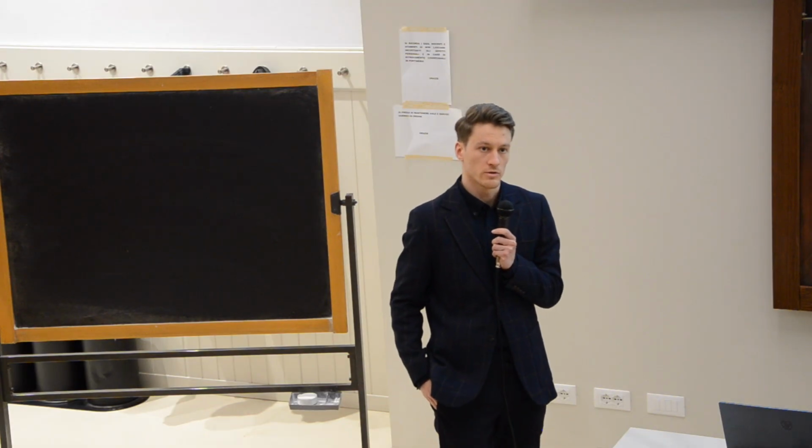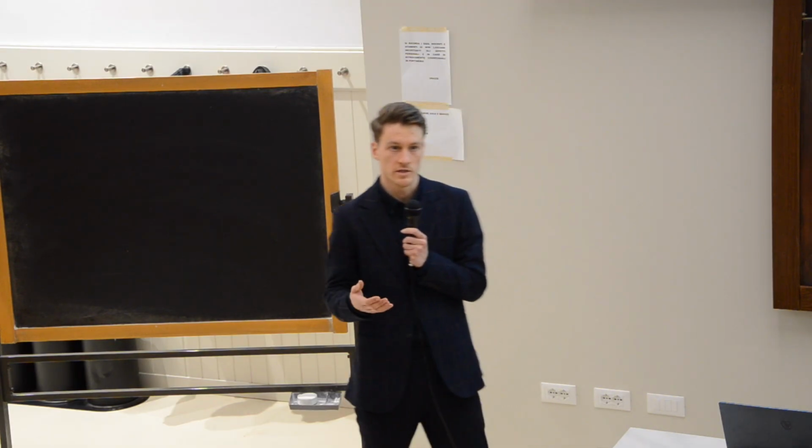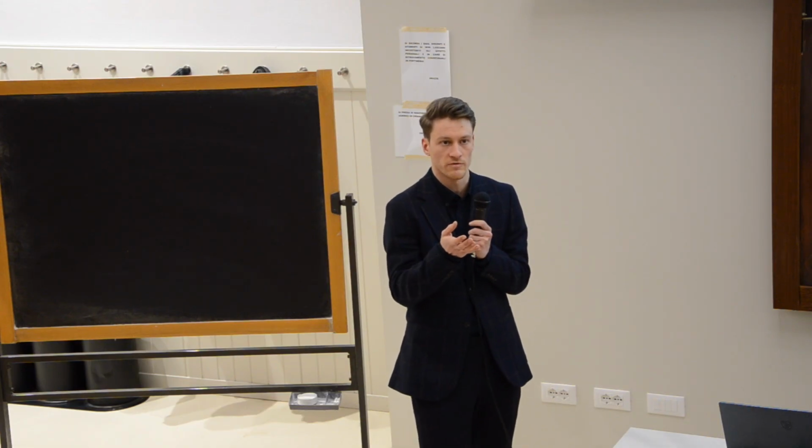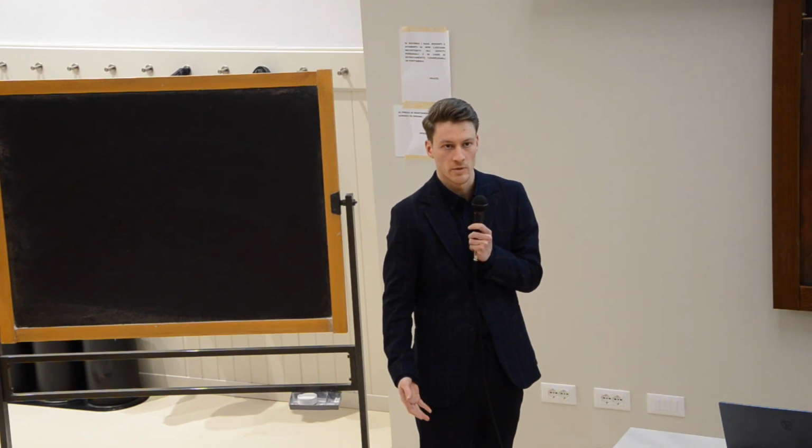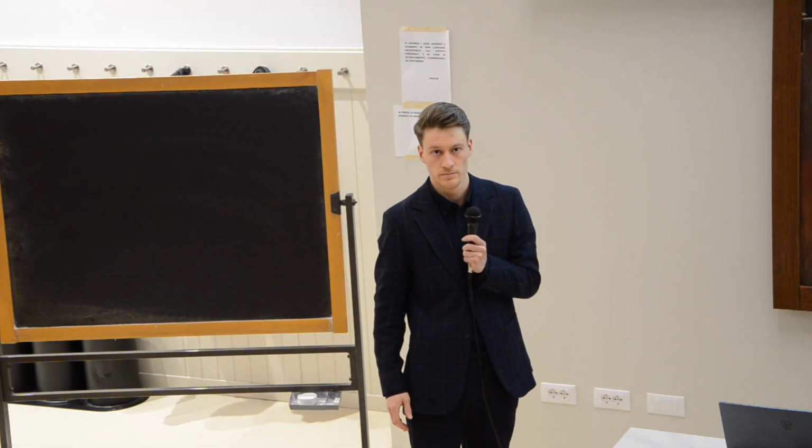Exactly. Which is why I said that we maybe should not consider the score, but just the anatomy to get a rough picture. But you would have the same issue as you pointed out before with the markers, right? If you place the markings on the muscle and you have hypertrophy, this is the same. With the optical tracking, at least we can see how much it differs from time point 1 to time point 2, and ideally it just is a translation of what we see, an increase in muscle thickness. So we could account for that.